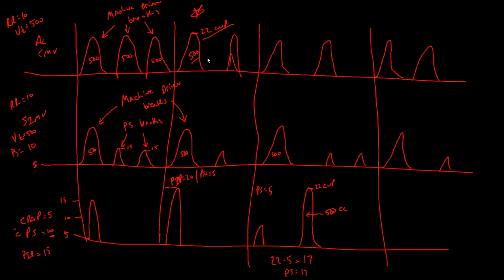But isn't it at the top up there? When you take a breath and you set an I time of the time that you want it to stay there. Yeah, so a plateau pressure, if I'm going to draw it, I would come up like this, and then it drops down just a little bit like that. And so this would be your peak inspiratory pressure. This would be your plateau pressure. Okay, that makes sense?